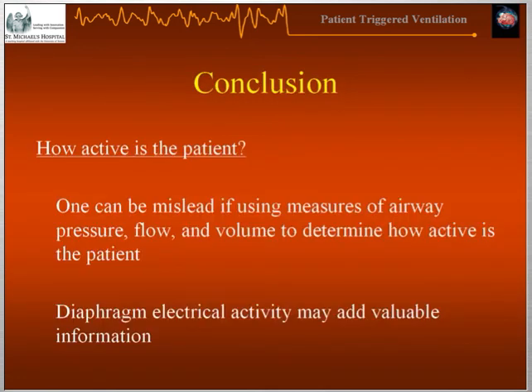So in conclusion, how active is the patient? Well, one can be misled if using measures of airway pressure, flow, and volume to determine how active the patient is. Diaphragm electrical activity may add valuable information.